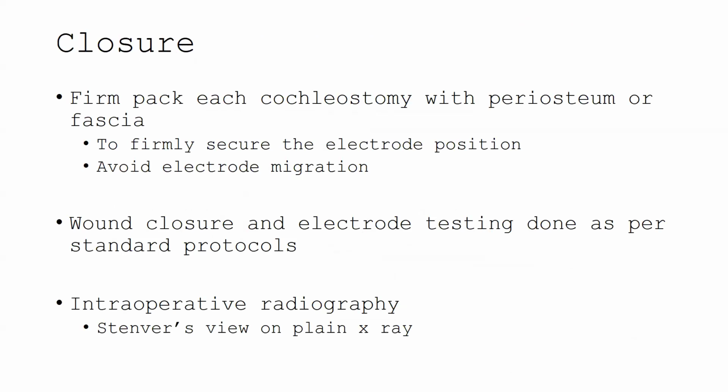Closure. It's important to make sure that each cochleostomy site is tightly packed. You can use either periosteum or fascia.